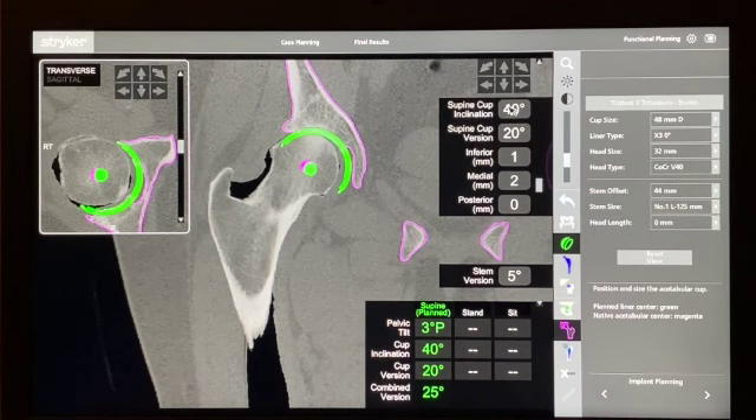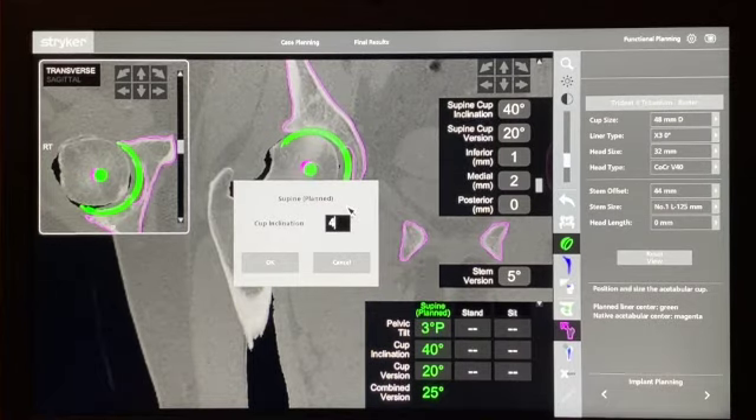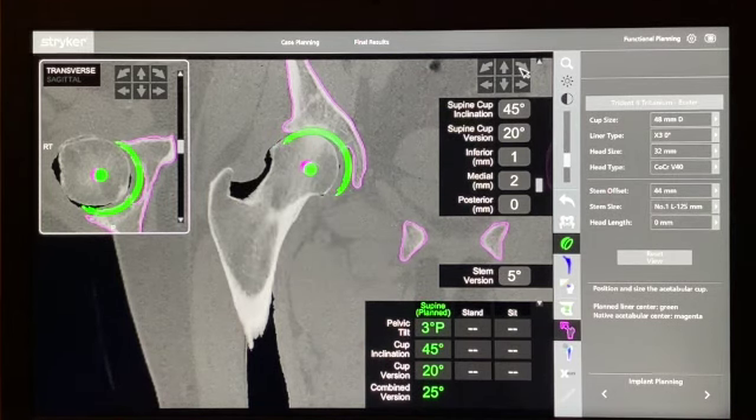These values can be changed by typing in a number or using the buttons to dial up and down. It's not uncommon to get a little uncoverage on the supralateral aspect, but this is more than I'd like. So I'll tuck the cup in a little more and bring it closer down to the true floor. Raising it up by a couple of millimetres gives better bone coverage and more closely matches the centre of rotation of the femoral head, with very little uncoverage of the lateral acetabulum.